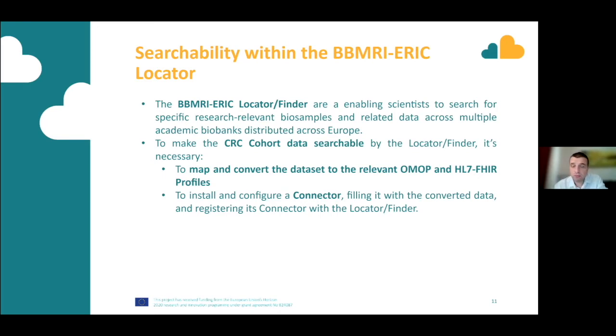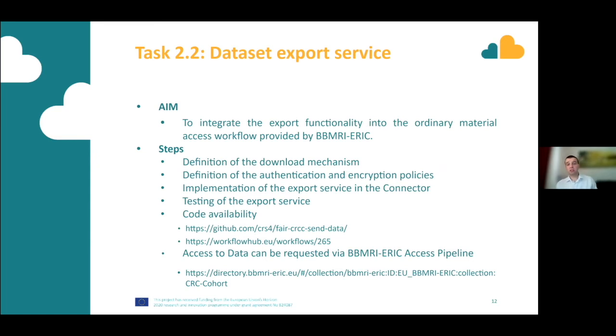And once these things are done, we're then supporting the export of the data using encrypted channel to cloud-based data processing services.